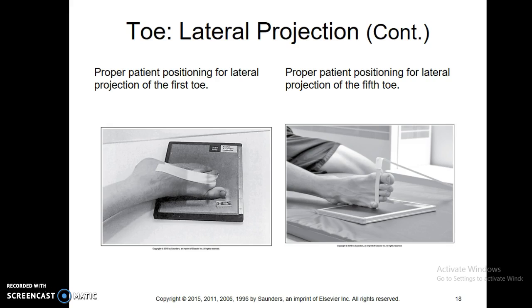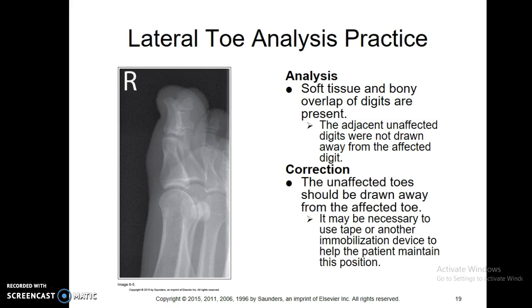Tape definitely can help. I'll tape the individual toes a lot of times because the big toe, you can really move that pretty well. The 2nd, 3rd, 4th toes, usually you can put one piece of tape on those, but every once in a while I'll put a piece of tape on each one of these just to open it up a little bit more. A little bit of overlap there, so not out all by itself.